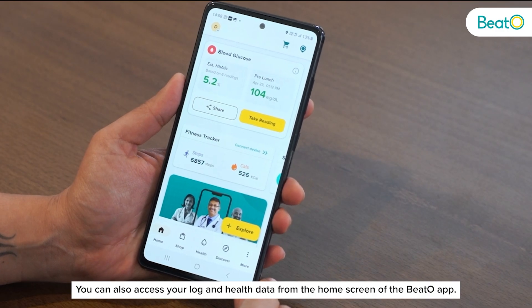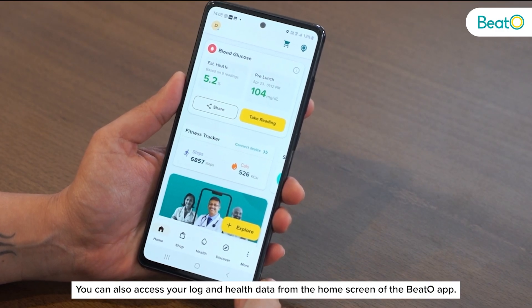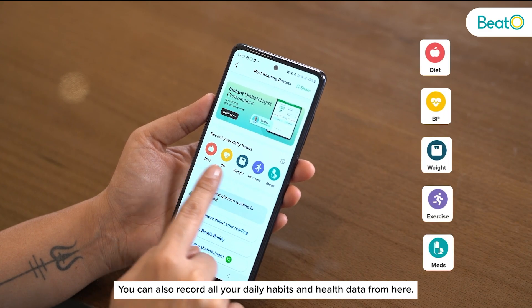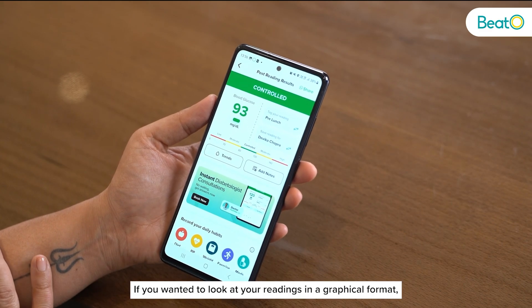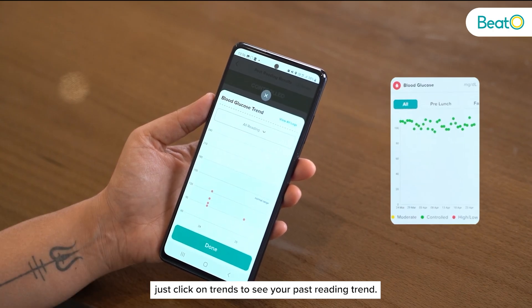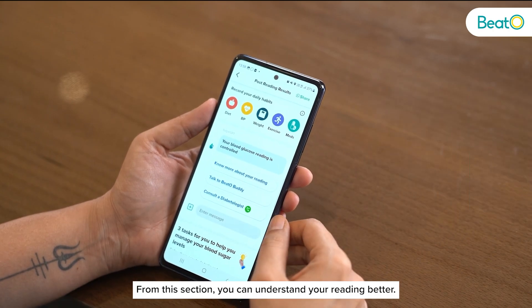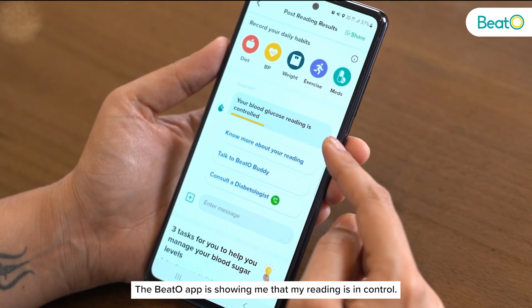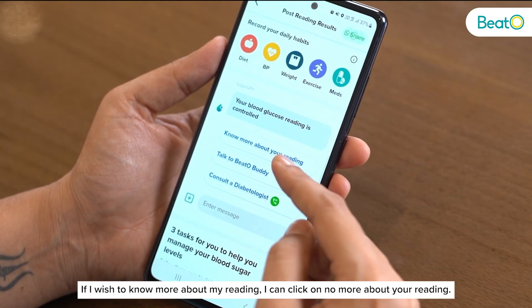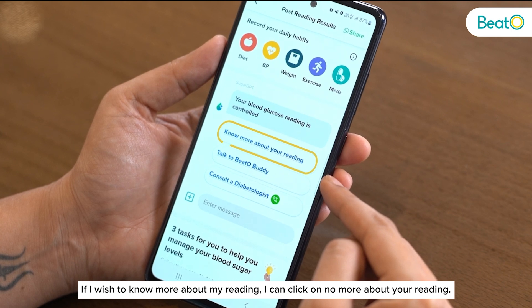You can also access your log and health data from the home screen of the Beto app, and record all your daily habits and health data from here. If you want to look at your readings in a graphical format, just click on 'Trends' to see your past reading trend. From this section you can understand your reading better — the Beto app will show whether your reading is in control, and if you wish to know more you can click on 'Know More About Your Reading.'